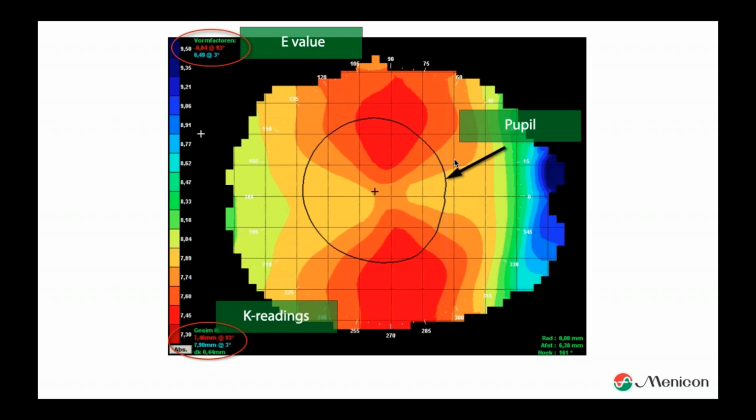Some topographers show pupil size as well, and there's something I have to mention about it. Keep in mind that some topographers don't measure it. If you have a topographer that doesn't measure it, well, you don't miss anything because it is quite unreliable. One of the things is you are looking into a light bulb. The rings will turn white or red, depending on the topographer you have. So there will be much more light on the eye, so it will contract the pupil size.